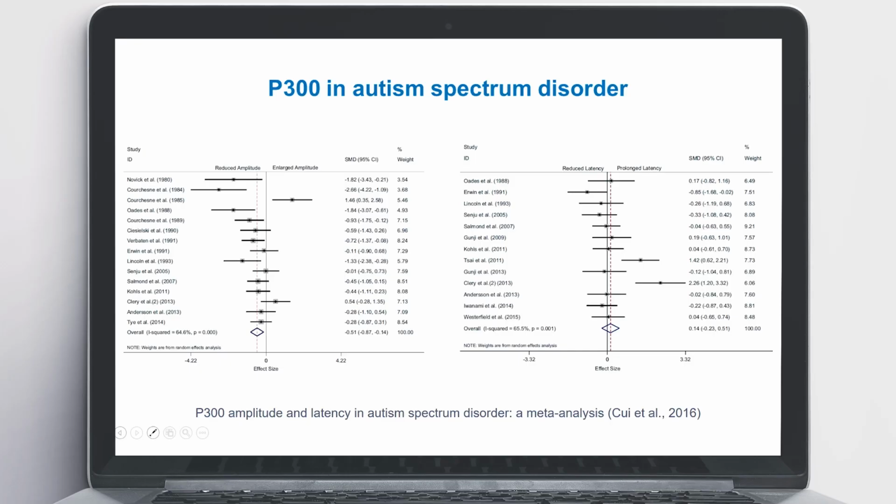The P300 paradigm is often used to assess impairment in autism spectrum disorders. However, the data obtained for autism is quite inconsistent. The main causes of this disparity are dissimilar paradigms and experimental methods used by the researchers, as well as small sample sizes. The auditory form of the P300 test is the most commonly used type of testing for autism. The selection of this test is related to the disorder's auditory information processing deviations.